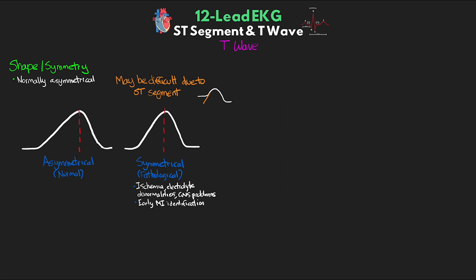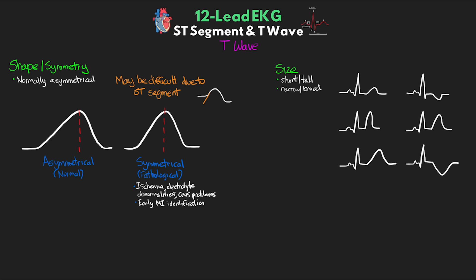Along with shape and symmetry, we also want to look at the size of the T waves — things like short and tall as well as narrow and broad. Tall narrow T waves are common with hyperkalemia, while broad T waves can be present with various CNS problems. Here are a few examples: asymmetrical waves both positive and negative, tall peaked T waves, tall and broad T waves, and very broad T waves — think CNS — both positive and negative. Generally, we don't expect to see the T wave more than two-thirds of the height or depth of the QRS complex; that would be considered abnormal.